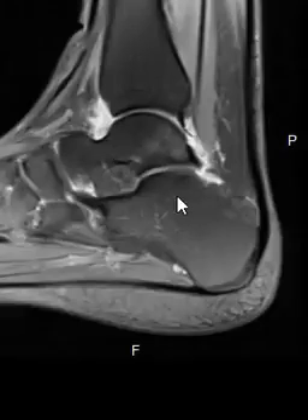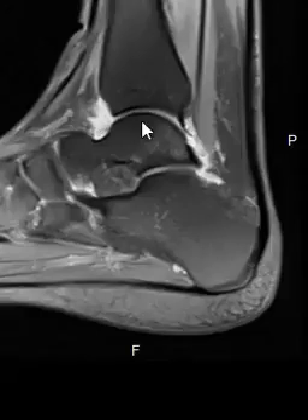Up here is the ankle joint — this is the tibia and talus that make up the ankle joint. We can see white in here; this white material is fluid, a joint effusion. That lets us know that something is going wrong.